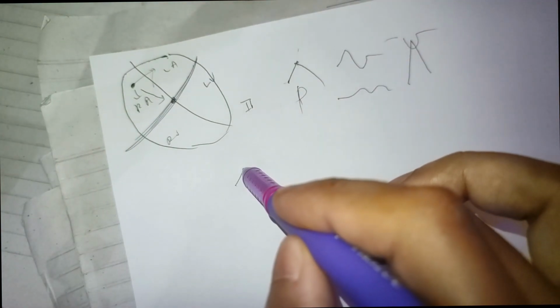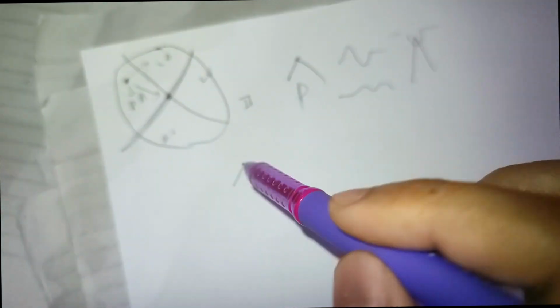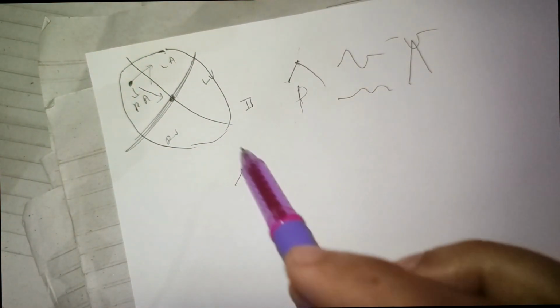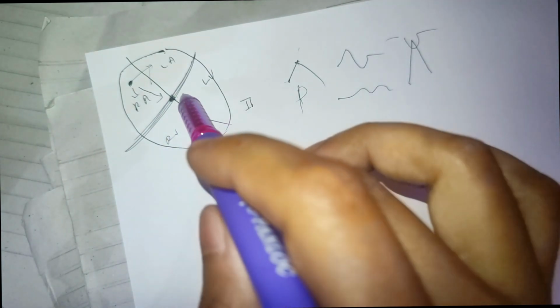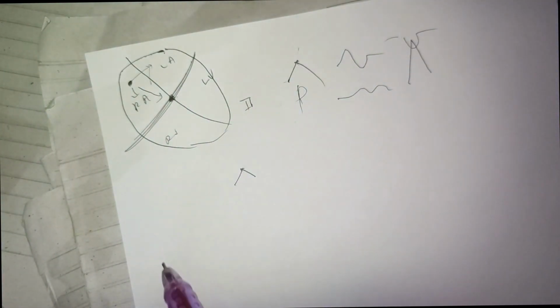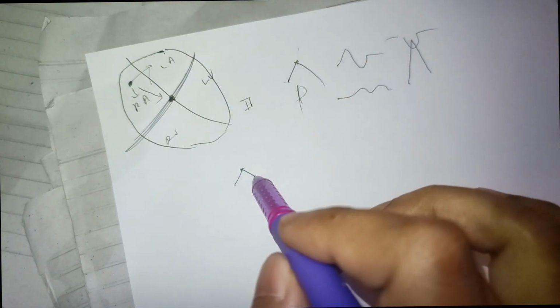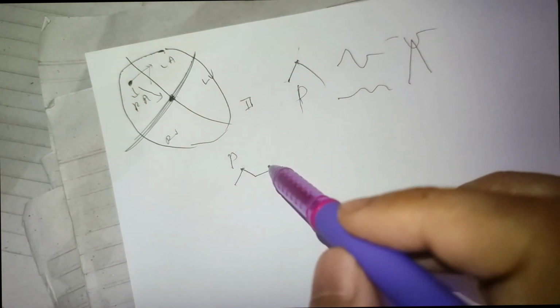So the current is depolarizing in this direction, so just one deflection by the ink pen in the ECG machine. Now the other part needs to be depolarized, so there is another deflection like this, right? Now the current reaches here, but there is a pause. It does not let all the current go to the ventricle directly. There is a pause, a delay here, that is the atrioventricular delay. So the pen does not deflect now, so you will get this line, the isoelectric line. So this is the P wave and this is the isoelectric line.